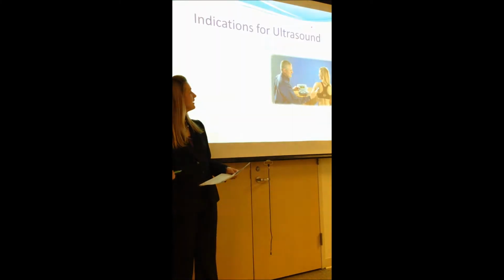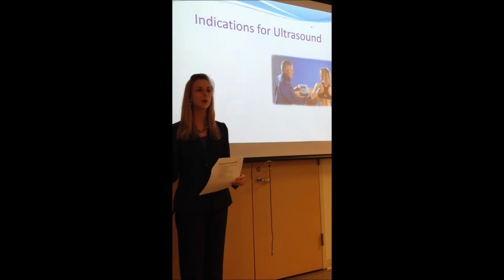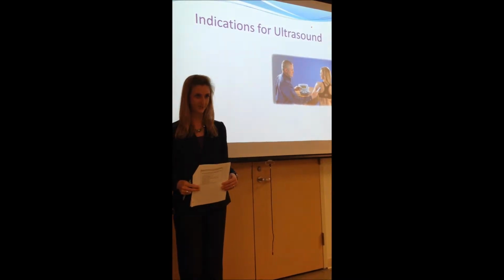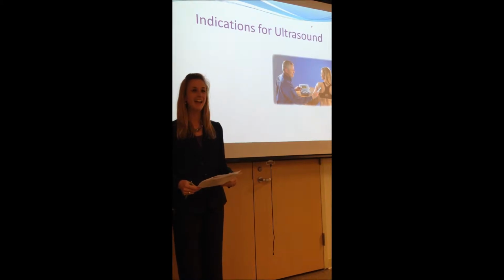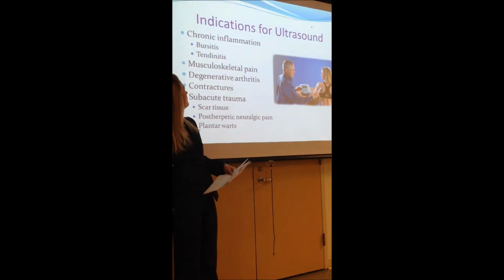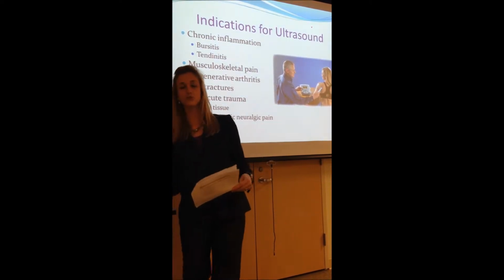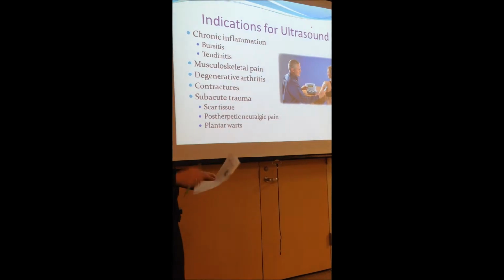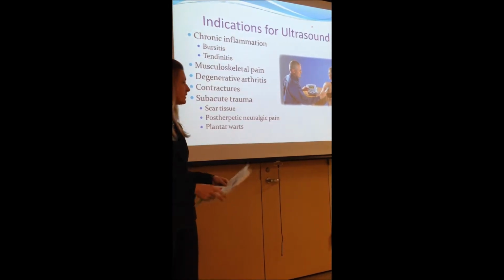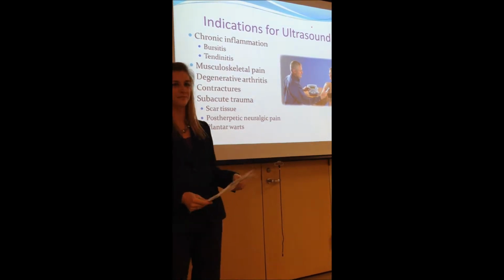Our first slide talks about indications for ultrasound. Can I get some people to throw out some ideas of why we would do ultrasound? Pain, inflammation, arthritis. Absolutely, those are three great ones. There's also contractures or subacute trauma. If you have some scar tissue you want to break up, ultrasound applies some deep heat, which can calm down those areas. But you got the big ones, so great job.